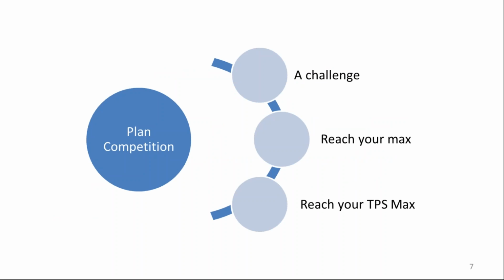In the plan competition, we are trying to get planners worldwide to reach the maximum of their own treatment planning system, and also reach the maximum of their own capability, through putting them in a challenge.